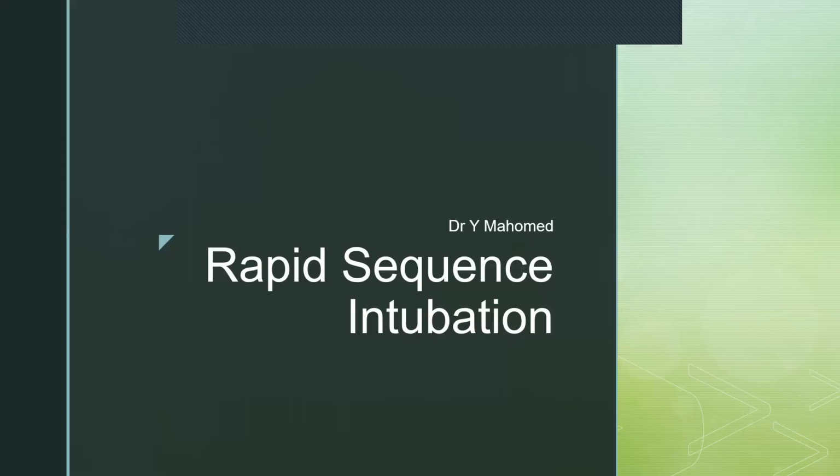So there's what we call, and what we're going to concentrate on now, rapid sequence intubation. And the other one is called delayed sequence intubation. Now, delayed sequence intubation is something that you see more commonly in anesthetics, in theater. We also use it in the emergency department. But rapid sequence intubation basically means that you've got to do it quickly. That's basically what it means.